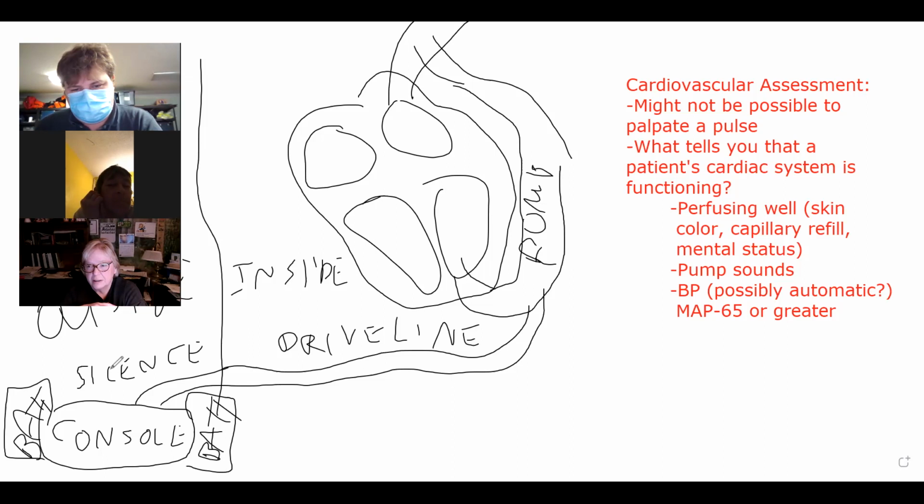And is there an alternative to plug the unit into a regular AC outlet while the batteries are recovering? Yeah, that's a great question. I wish I could tell you a little more about the charging efficiency of the batteries. I'm not 100% privy to how long it takes for one of these things to charge. Many models do offer a direct connection to electricity for a short period of time.